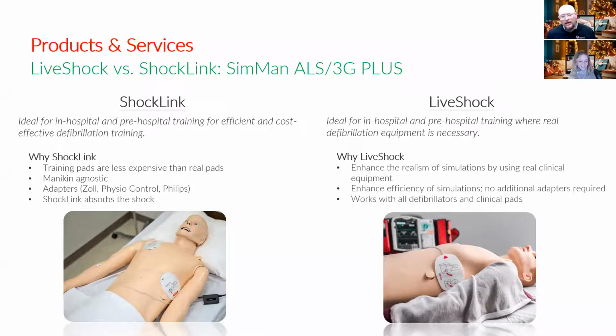If you're connecting ShockLink to your clinical defibrillator, it will require an adapter. It comes standard for Philips, but then you have to get an adapter to go with either Physio-Control or Zoll. You can always reach out to your CE or ask to get one quoted. And as a last resort, send us an email at HSL at Laerdal.com. So that's the reasons why you would go with ShockLink.